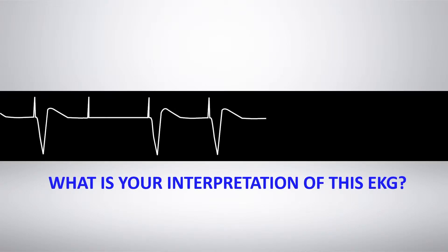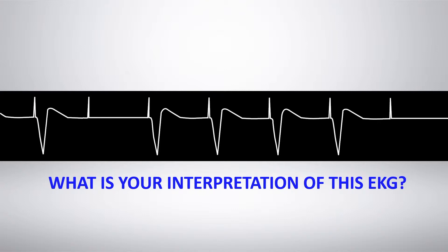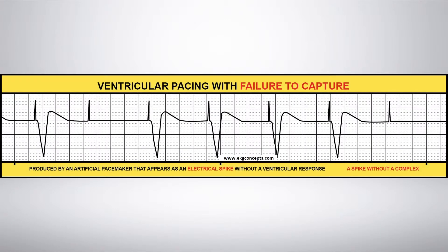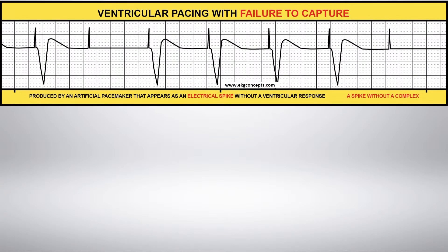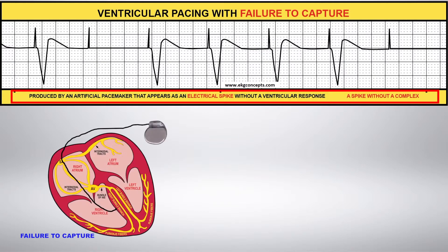What is your interpretation of this EKG rhythm strip? Ventricular pacing with failure to capture. Ventricular pacing with failure to capture is produced by an artificial pacemaker that appears as an electrical spike without a ventricular response — a spike without a complex.